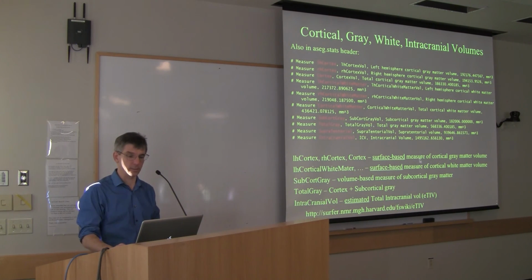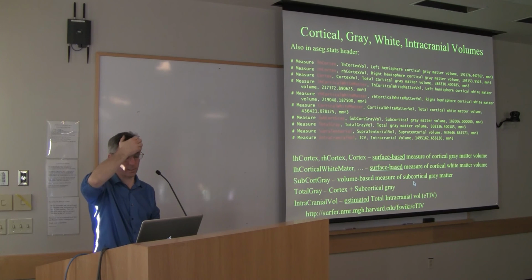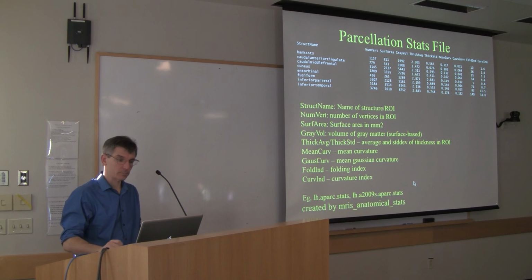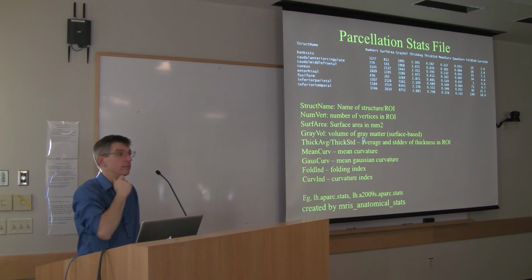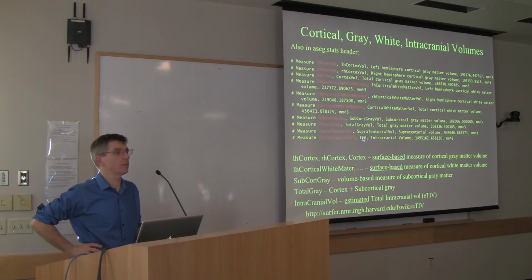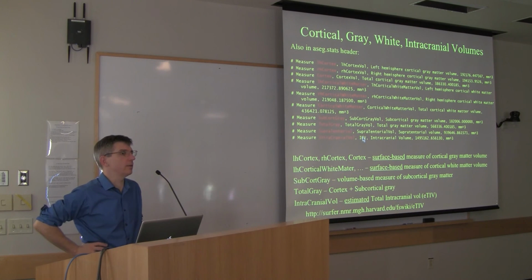Randy Buckner was the one who developed this technique, and he has a paper which you can get off of our wiki. It's about the estimate of intracranial volume. Does it get affected if we had bad skull stripping? Does the estimate of intracranial volume get affected if you have bad skull stripping? It does not, because it's only generated based upon this registration, and the registration is done before skull stripping.